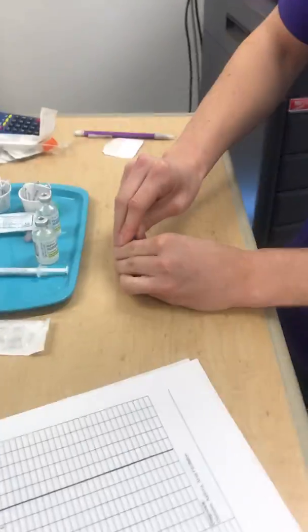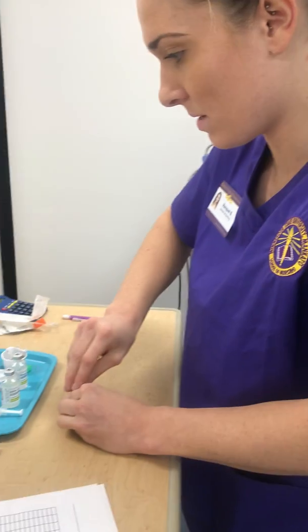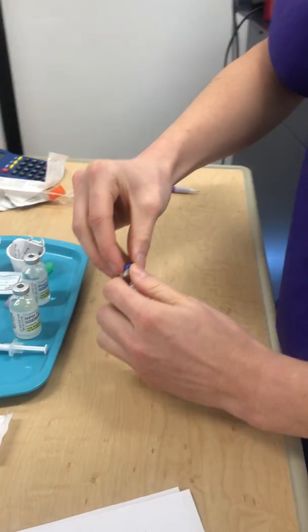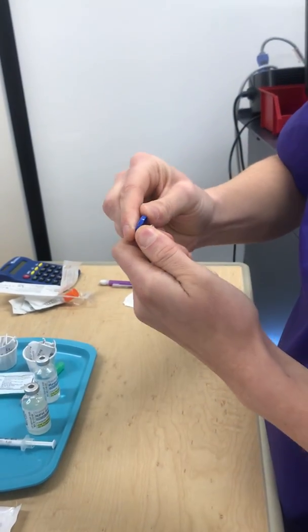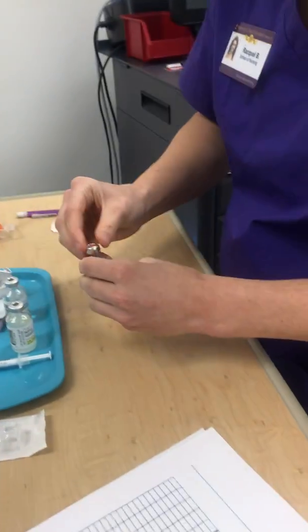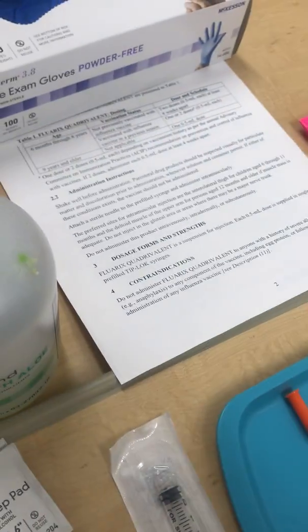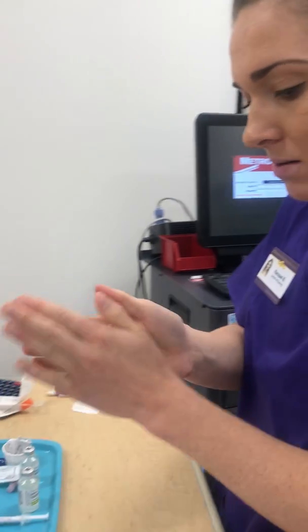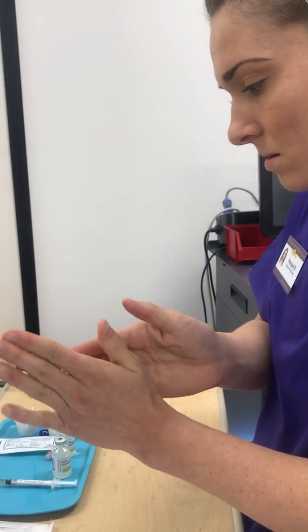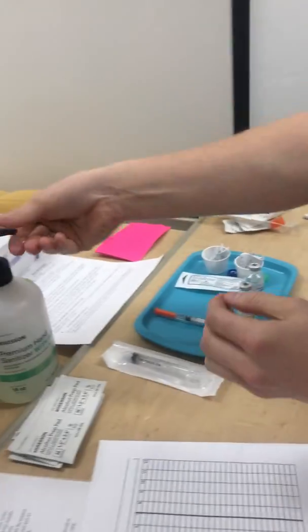So we're going to take this cap. Oh, I guess I'm going to wash my hands first. I'm going to take this cap off here. Okay. And then on the sheet it said that you should shake it, but I'm just going to roll it to be safe so we get no bubbles, about 10 to 20 times. Just don't want that. Good. That's good. And then wash my hands one more time just after touching that.